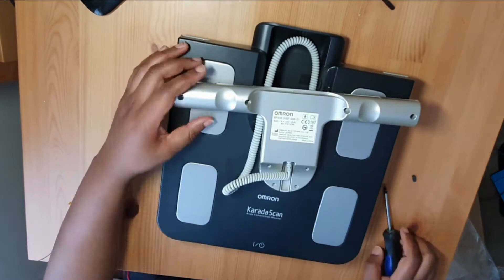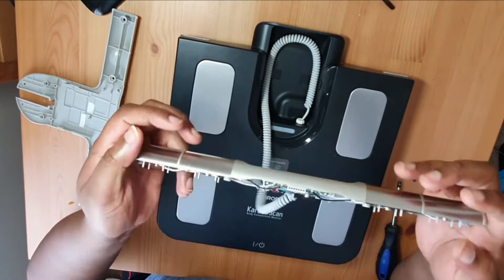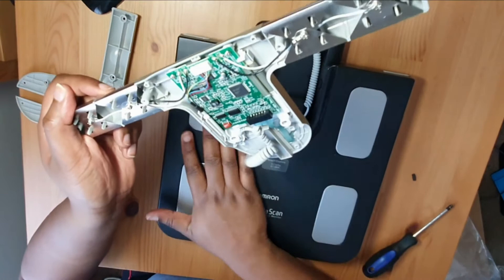Just taking out those screws — this lifts up and opens like so. I'm assuming these pads here are for things like measuring BMI, possibly heart rate. Actually it says HTR — heart rate. This is very good. And I'm assuming this will carry the information from the scales — the weight — from these bits here.